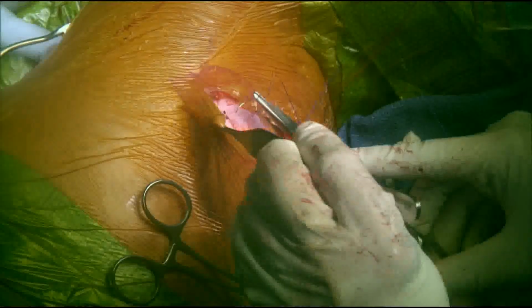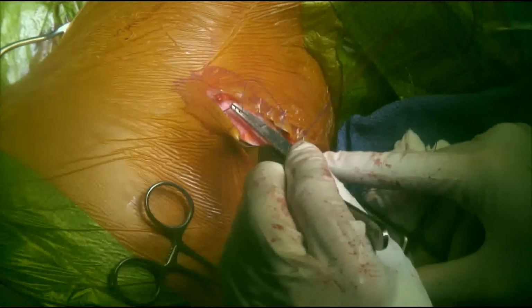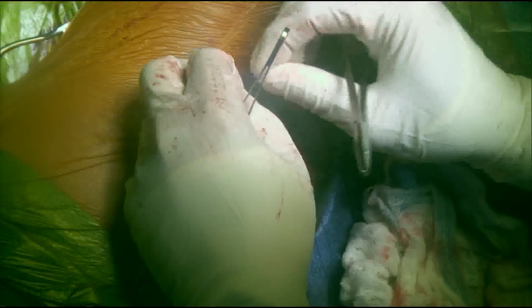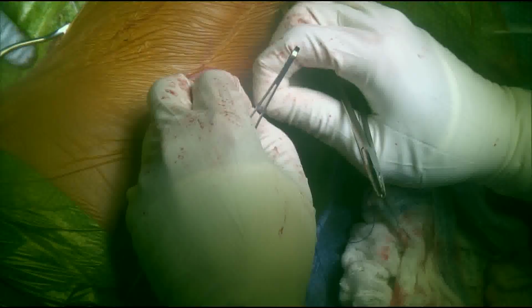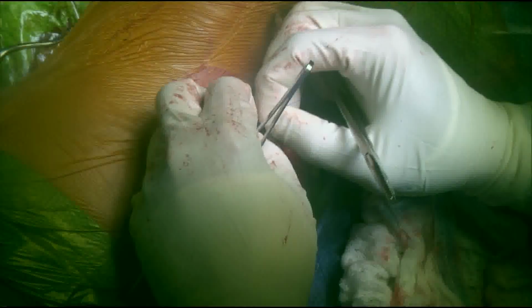Some surgeons prefer to only place 2 anchoring sutures, while other surgeons prefer to place all 4 of them at all corners. Should you decide to use only 2 sutures, it is important for these to be at opposite ends, as in the top right and the bottom left, or vice versa with the top left and the bottom right.